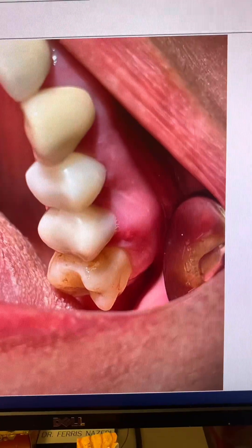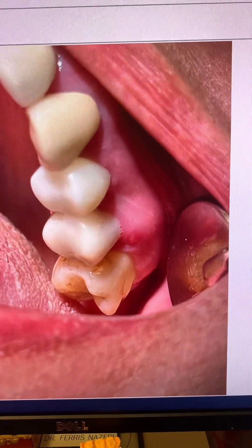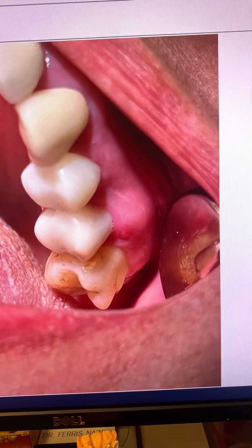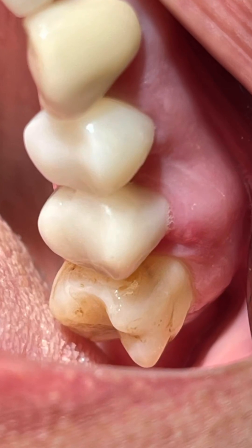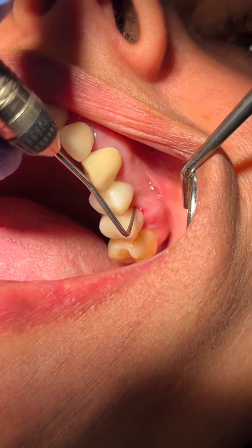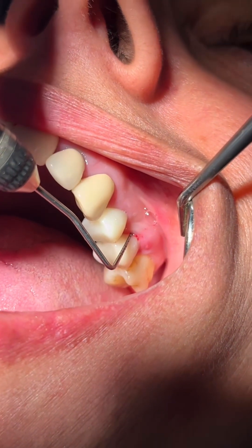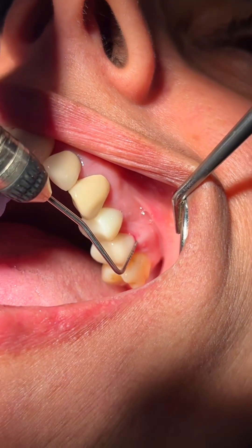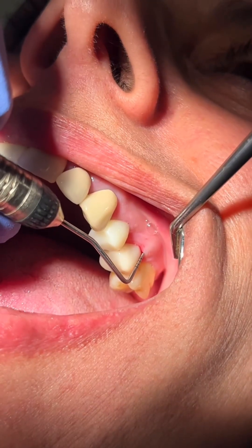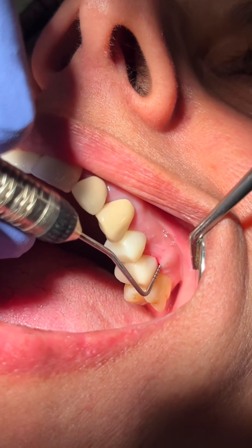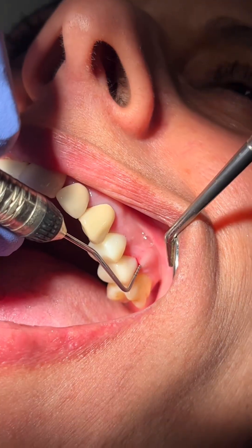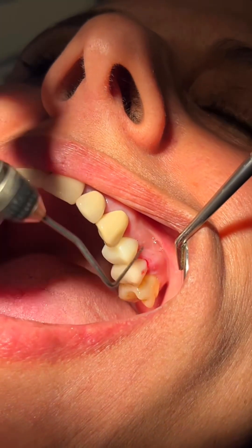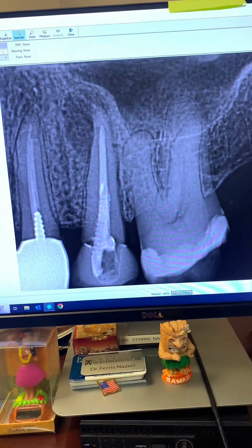So let's go ahead and probe this tooth. Starting from the mesio-buccal — right here you can see I'm getting one or two millimeters. And then right where the sinus tract is, right at the marginal gingiva of the tooth, I can just push this probe and it'll probably go to nine-plus millimeters. So you saw the probing.